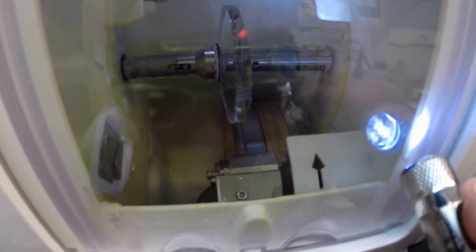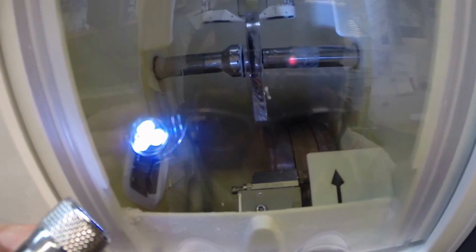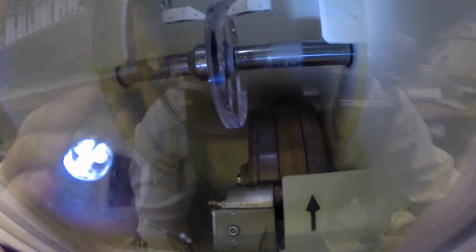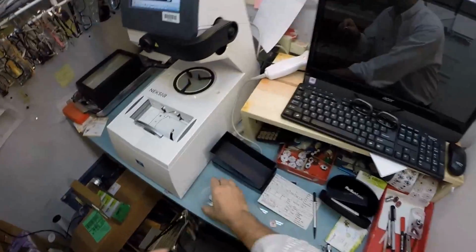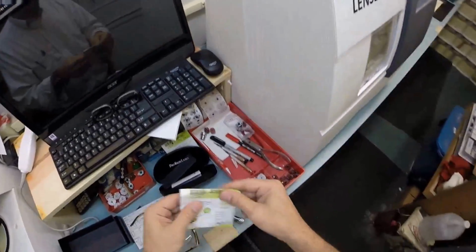The door closes, that clamp shuts, and then two white calipers up at the top are going to come down, and it's going to trace the shape of your right lens to make sure this lens is large enough to fit into your frame. As it goes around, it is measuring that. It actually goes around twice to measure the thickness of the lens at every point to make sure where to place the bevel in the frame. At every thickness point, it knows whether to move the lens forward or backward in order to put it into the frame where it fits best.